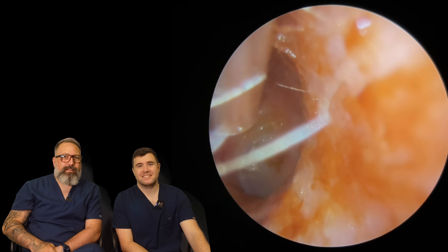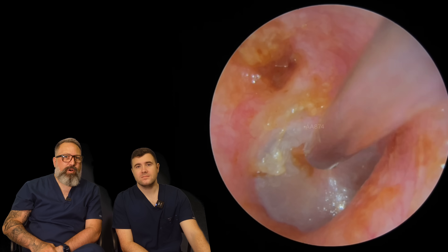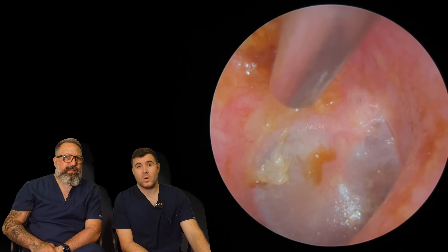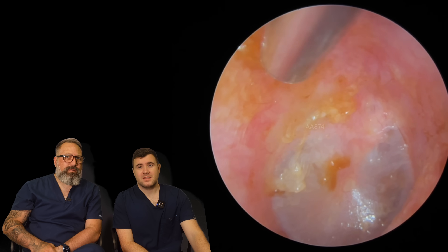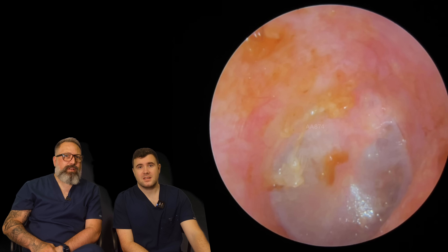Let's have a look, see how that's looking now. It's looking loads better. Just a little bit of a blob right in the middle. Just take that bit away. There we go. Look at that. And a little bit more. There we go. And that bit as well. Looking loads better there.